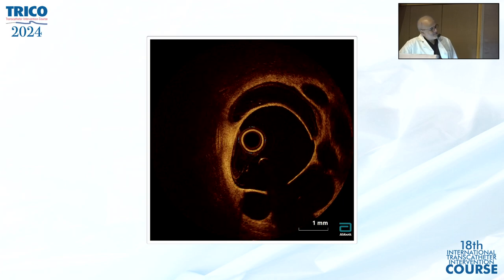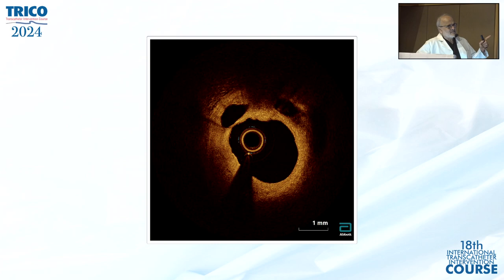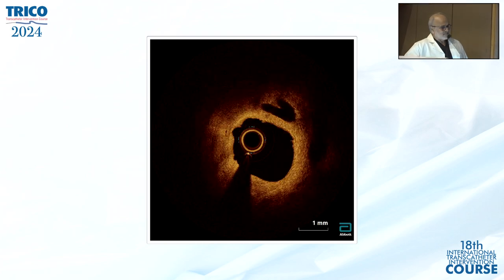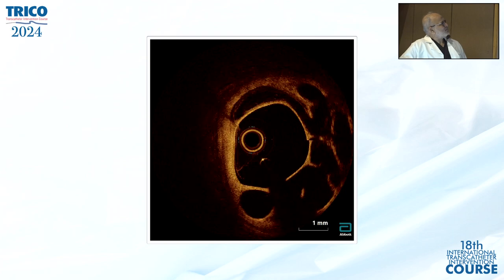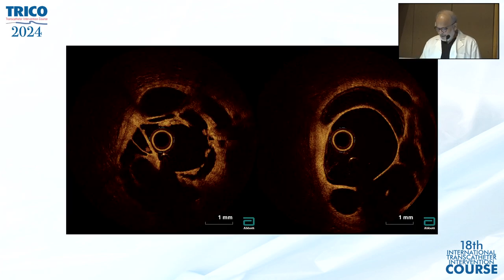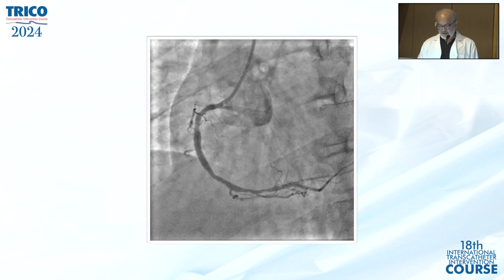This is what it is. This is a recanalized thrombus which has become tough inside. Honeycomb appearance. Again, just see this. Multiple level openings inside. And then we dilated and stented with a clean result here.